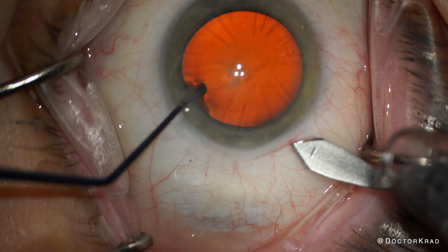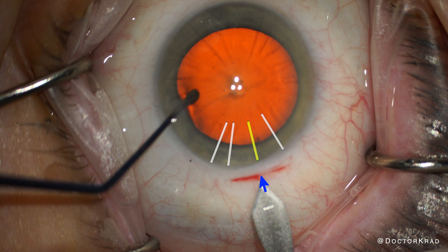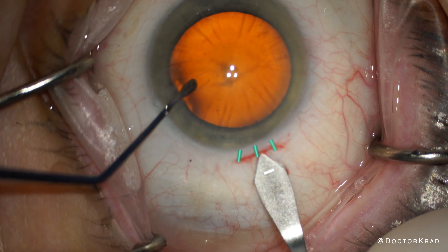I contemplated where to put my main incision. If I put it here on the left, I'll be getting close to two of the RK cuts. And if I put it on the right, I'll also be getting close to two of the RK cuts. So I decide to go right underneath one of the RK cuts, so I'm only risking the one.